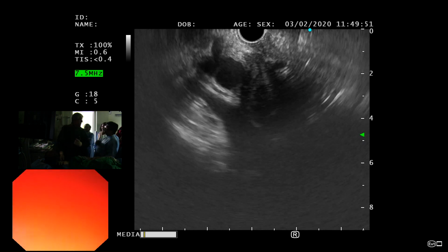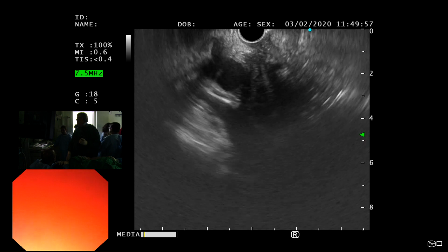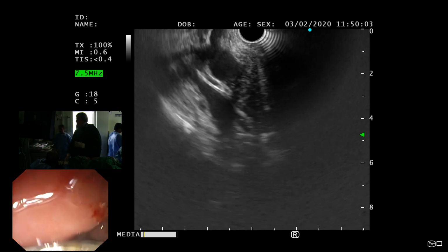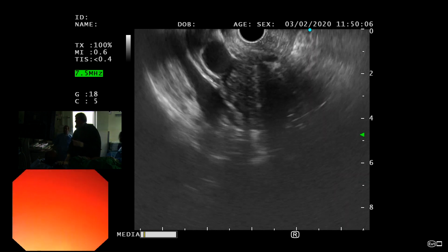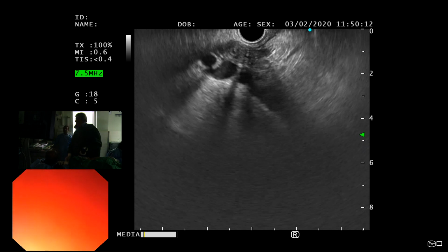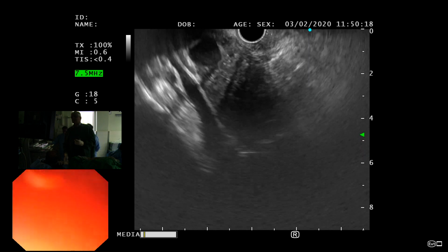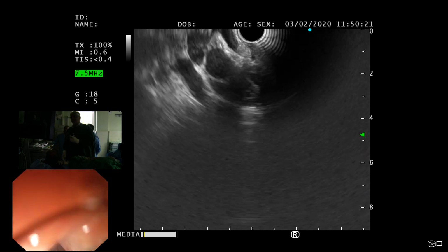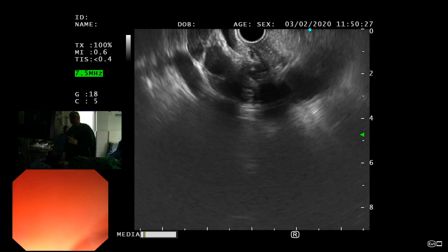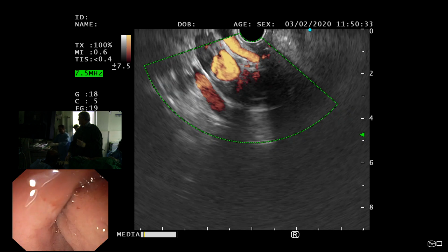कौन? नेक्स्ट अब अपन पैंक्रियाटिक हेड मैश एंड एब्डोमिनल पेन कौन सा करना चाहेंगे? पेंक्रेटिक हेड में ये एब्डोमिनल पेन ले लो. I can't see the pancreatic duct going. एक मिनट है. यहाँ पे आके I am not sure whether this is. एक मिनट है. डॉपलर देना. Keep it on. You see this.